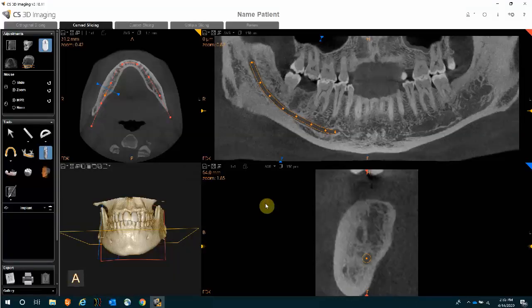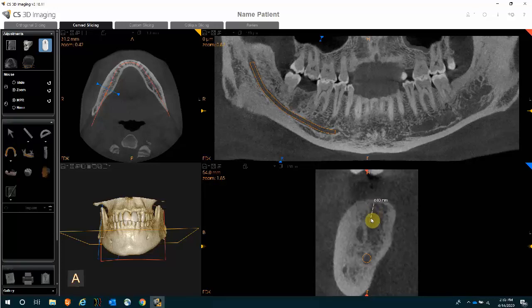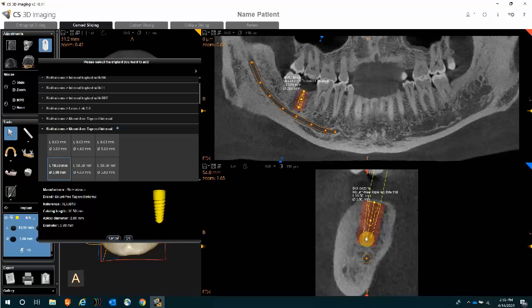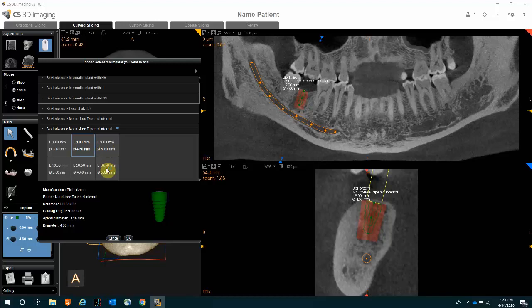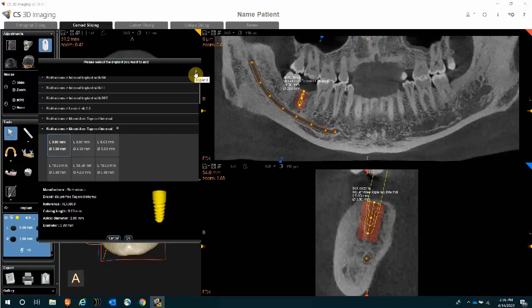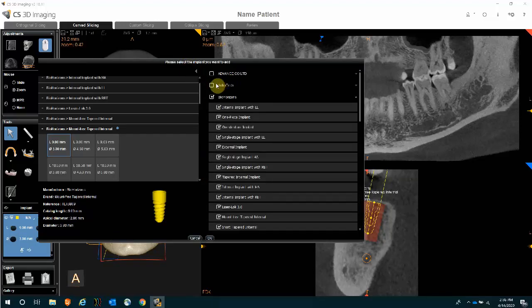Following those instructions: click at the top of the bone, drag down, move left or right to find the best angle, then click again. You are then presented with the implant sizes that will fit. If you're not happy with what the software suggested, you can go lower or change the size as you go through. If you'd like to select another brand or manufacturer, on the right-hand side you can expand the field and select another manufacturer.